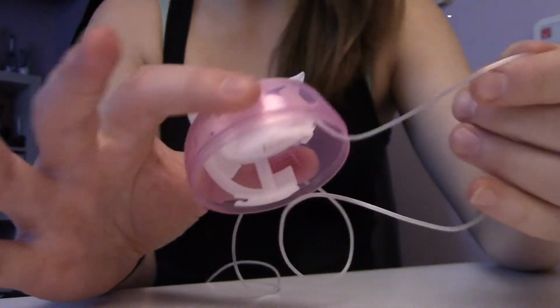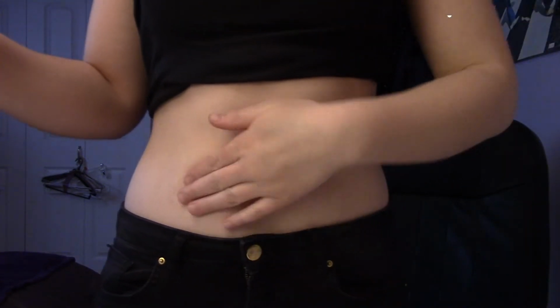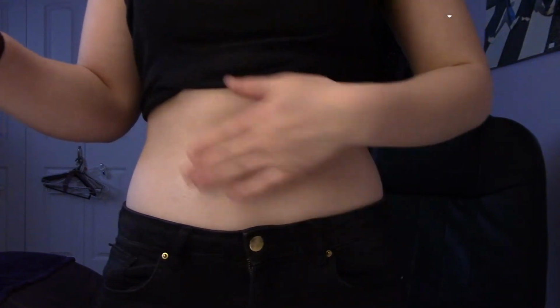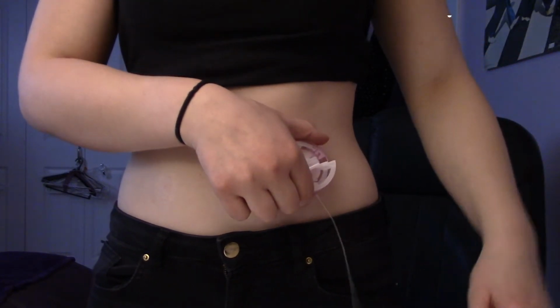And I've loaded it. As you can see, the white part is up and it's elevated in comparison to the rest of it. Sorry about my poorly defined abs there. So I had my insertion site on this side before, so now I'm going to put it onto this one. You want to make sure you're switching it up every time you change them, just so you don't get scar tissue building up. So I'm going to line it up like this.